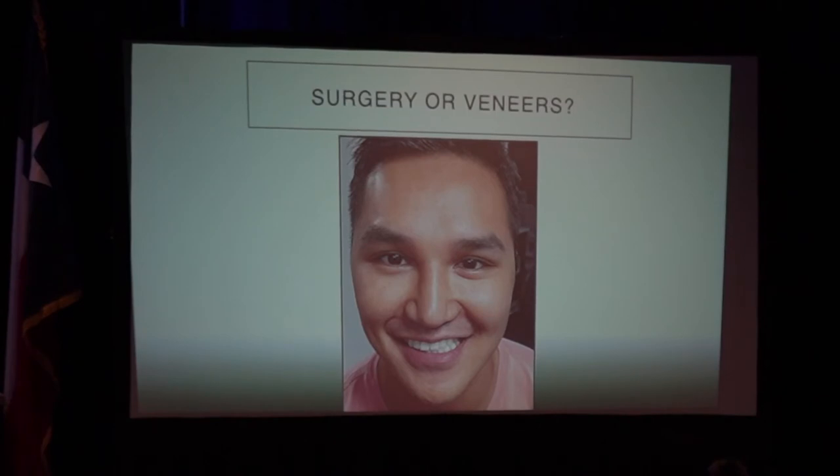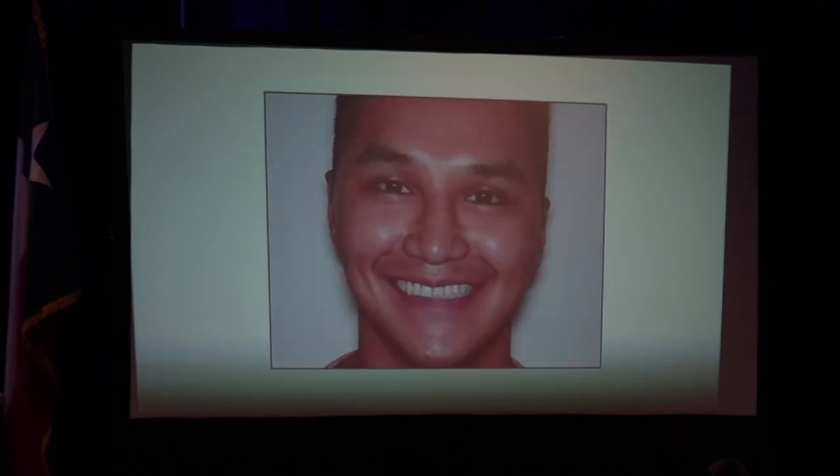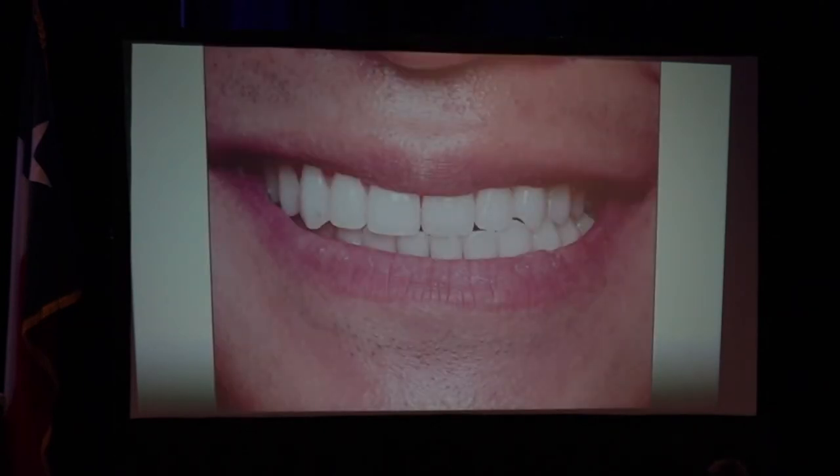So he's in dental school. He's a D4 student. I kept on telling him no. Sometimes you got to tell no because you're not going to get those teeth. There's no ceramics that are going to get those teeth and not break. So I tell him no. This is him. You can see his bite. Ortho left him like that. He said, they recommend if you want any better, go to surgery. He says, there's no way I'm going through surgery. So I'm still telling him no.